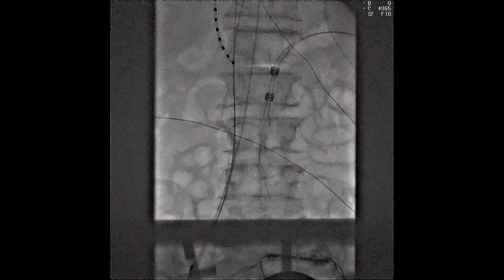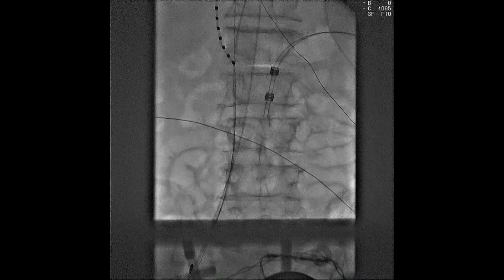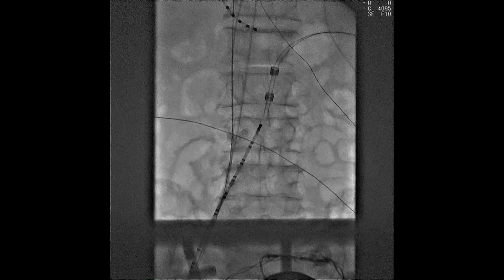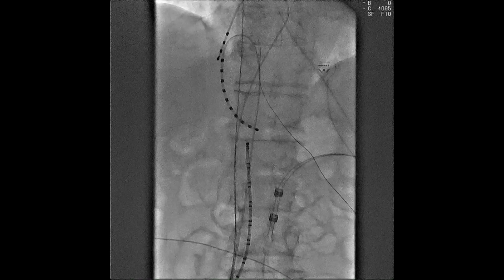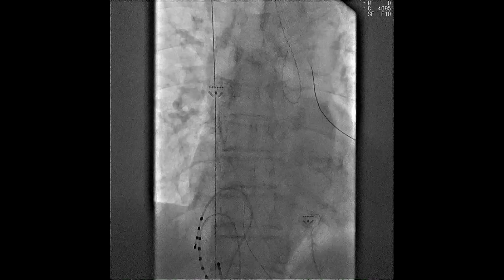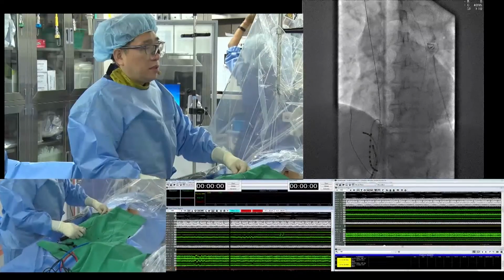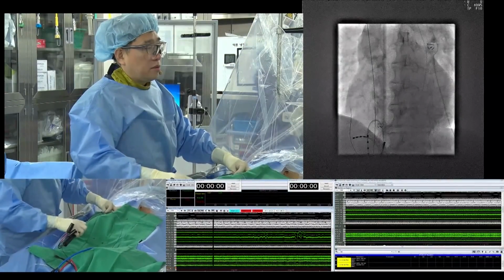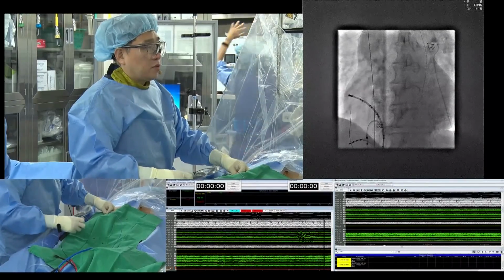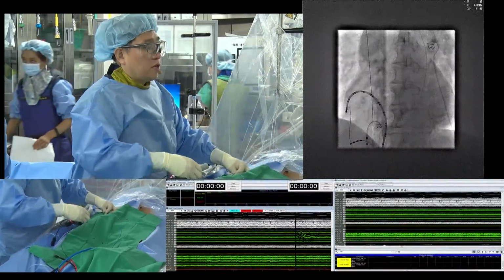Okay, that is the duodeca catheter positioning and maneuvering tips. You can push the duodecapolar catheter into the IVC. You can just follow the previous catheter and guide wire. And in LAO view, direct your catheter tip to the right atrial free wall side and make a full deflection down and counterclockwise torque. Make a figure 9 position in LAO view like this.